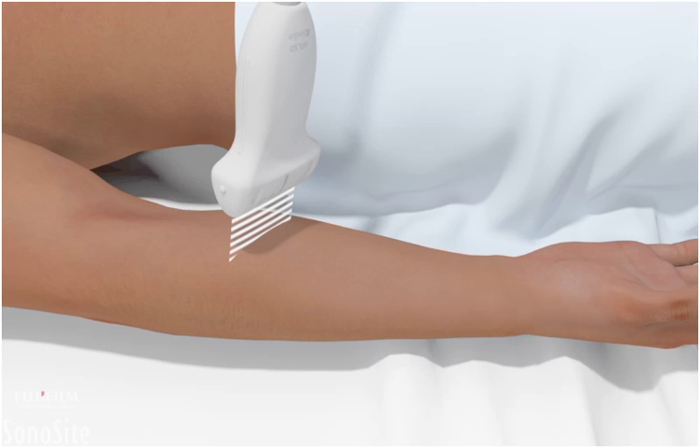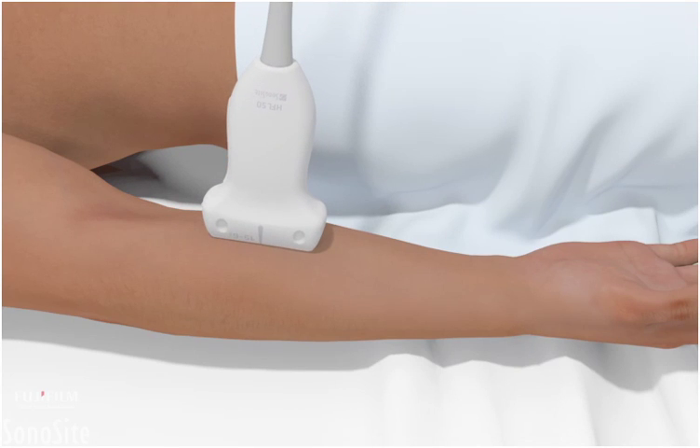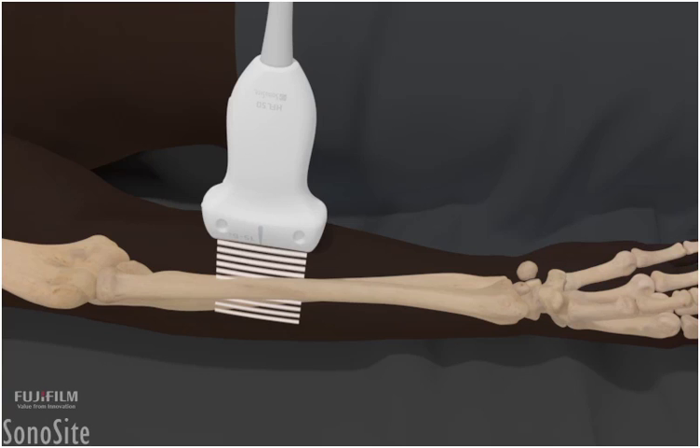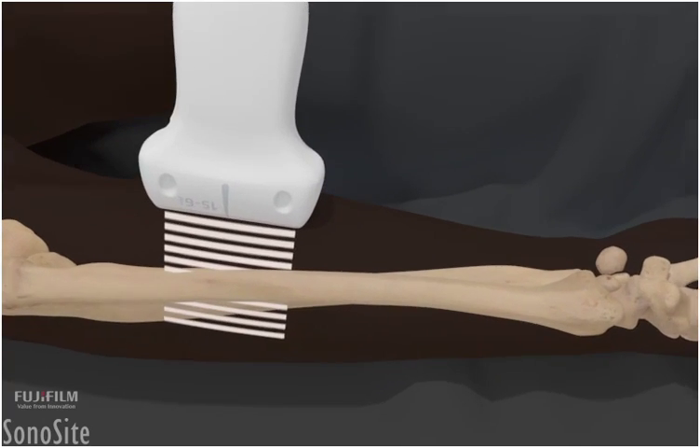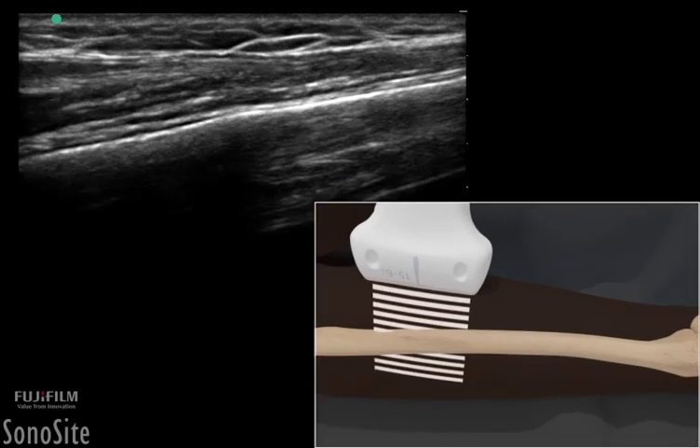A liberal amount of gel is used to reduce the amount of pressure over the injury site. The ultrasound examination should begin in the non-injured extremity to establish a baseline normal examination. The transducer is placed longitudinally over the extremity with the orientation marker directed proximally.